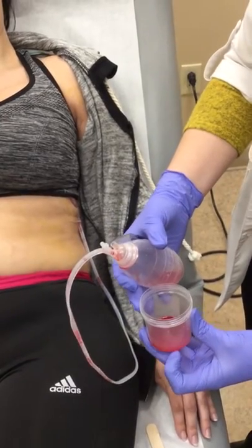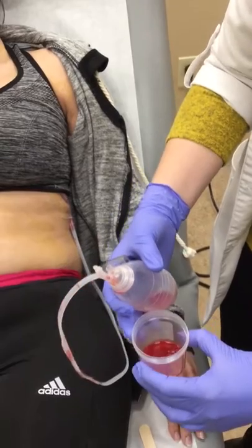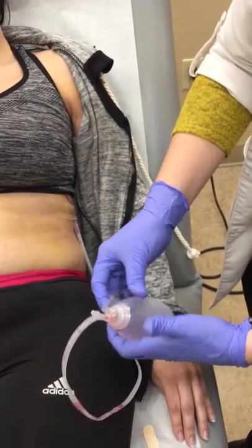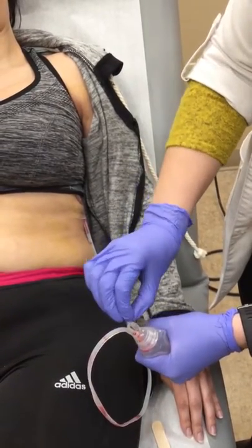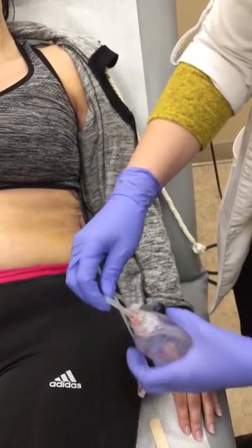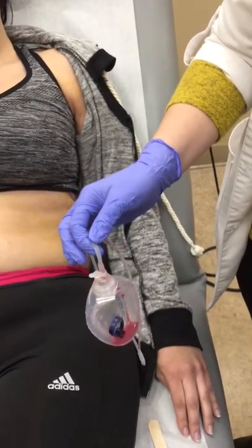Make sure that you do measure it — every little line is 10 mL. Write that down on your drainage record. Then take the drain, fold it in half, and put the lid back on. That creates your suction. You want to make sure it's always compressed, otherwise it's not doing anything for you.